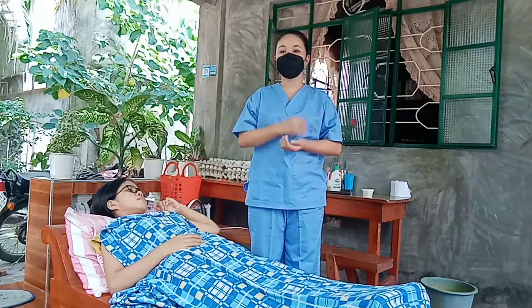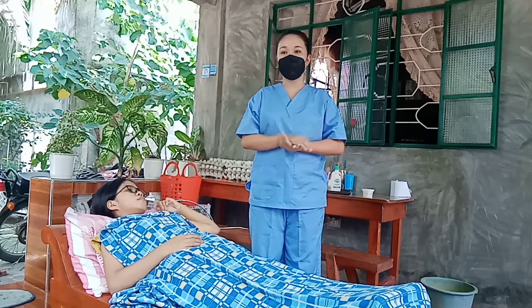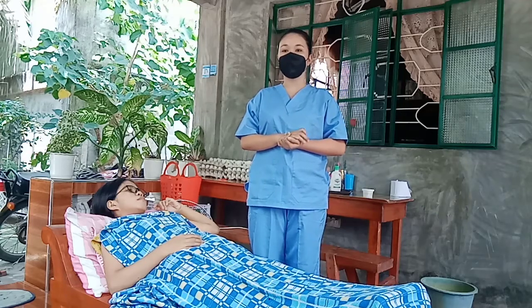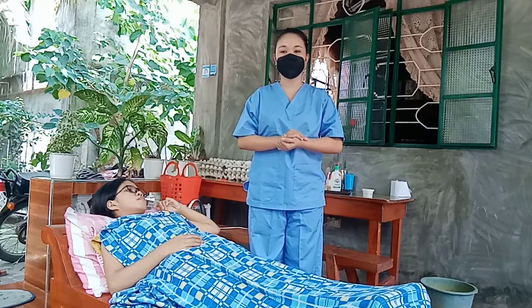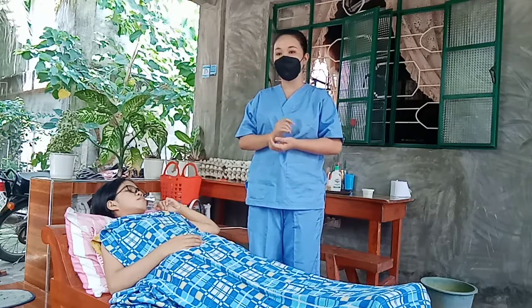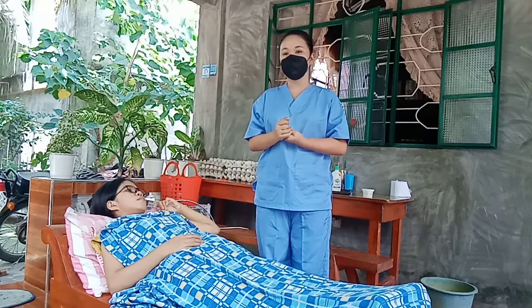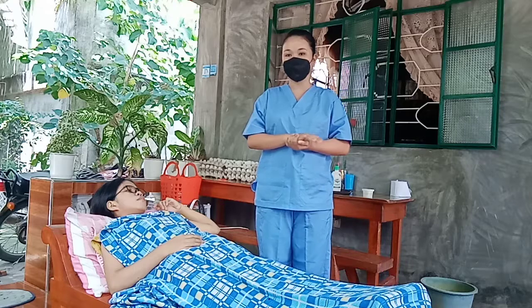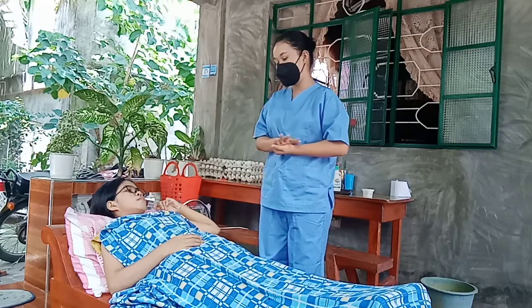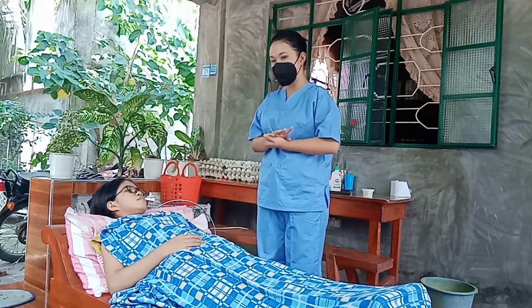So next is collect urine from indwelling urinary catheter. So letter A is explain the use of needleless syringe and that patient would not experience discomfort. The use of needleless syringe is to eliminate needle stick injury, then reduce needle reuse and cross-contamination. That is the use of the needleless syringe.